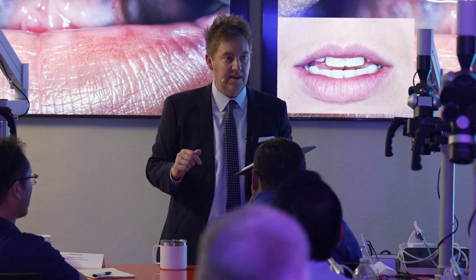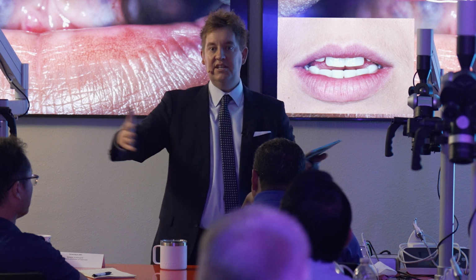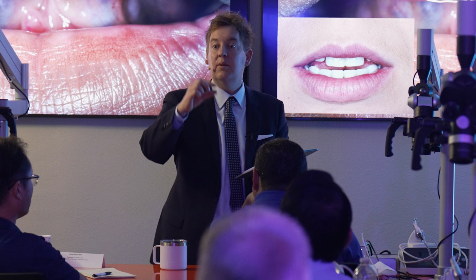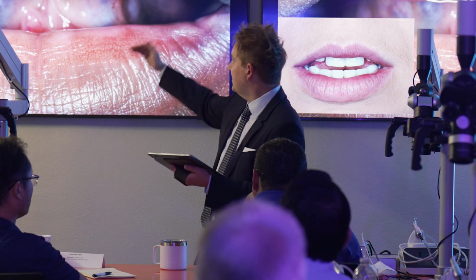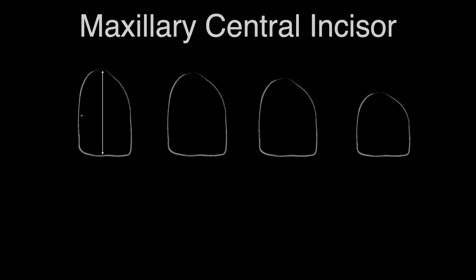We typically crown lengthen a little bit. We would change the height to width ratio of the tooth. You know, we have all these libraries of teeth when we set them up on dentures. So we would give them a little bit longer of a tooth because we've already established the ideal incisal edge position.